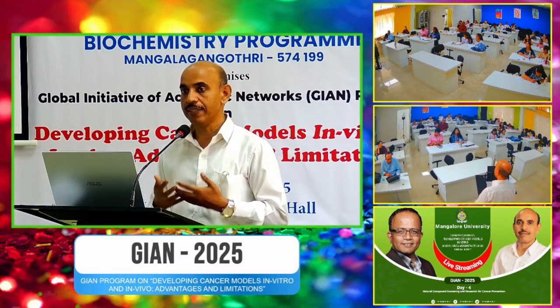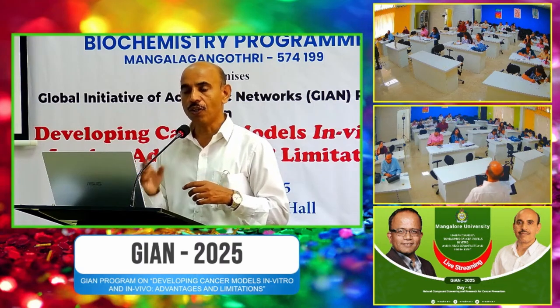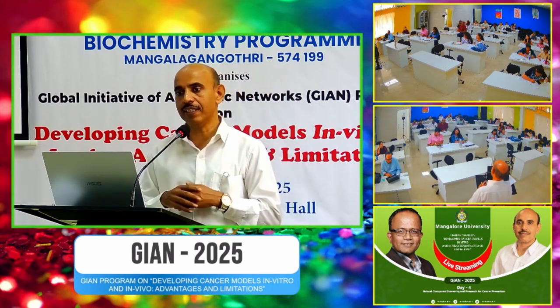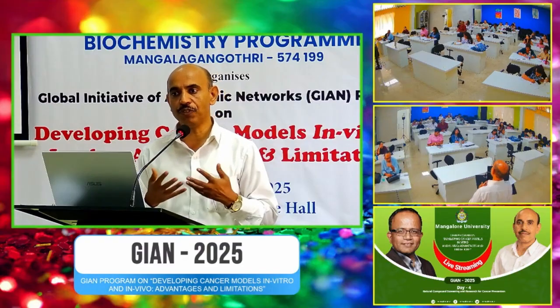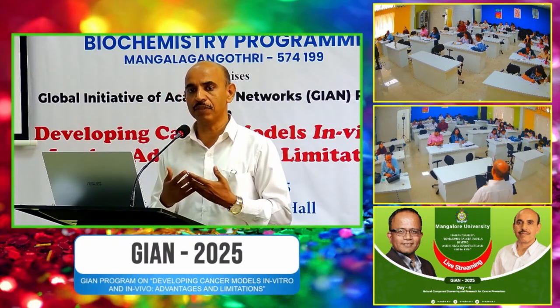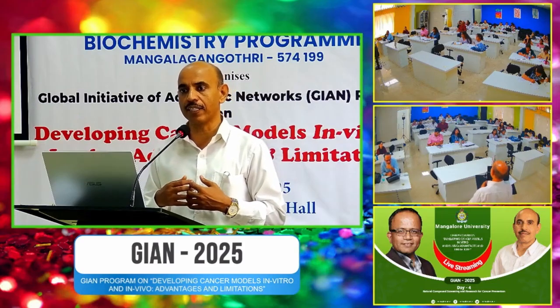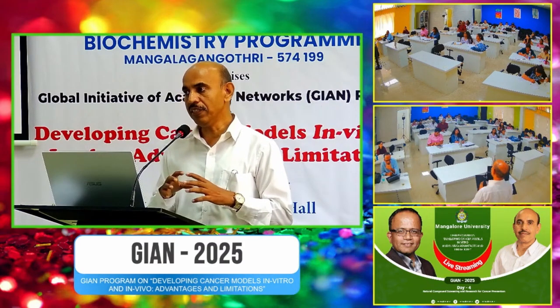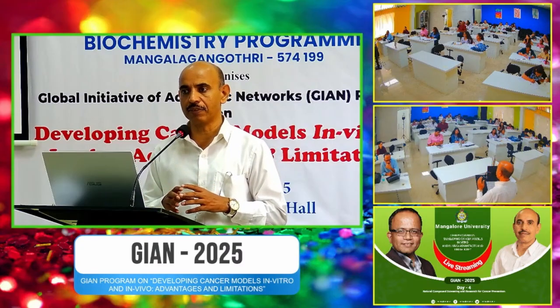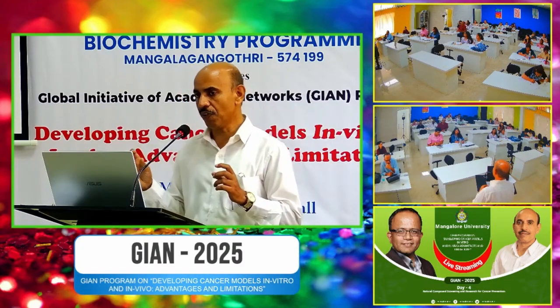Other things you should be aware of are contaminations which you are not able to recognize, and contaminations which you are able to recognize. Contamination from bacteria and fungi is very easy to recognize, because the media is added with phenol red.